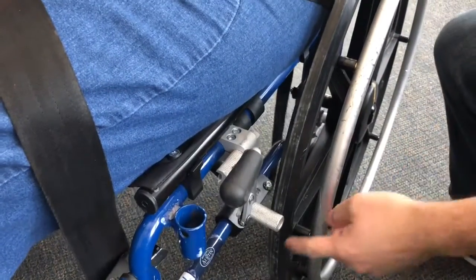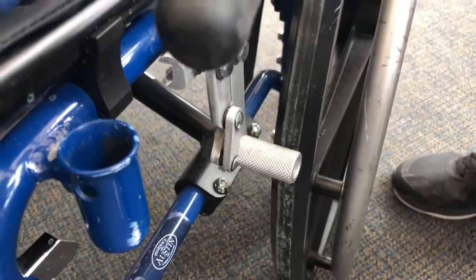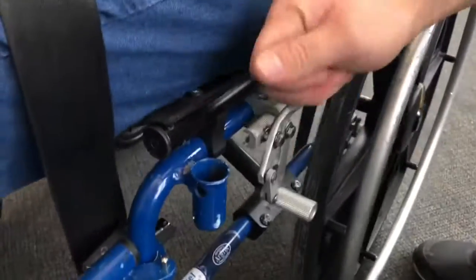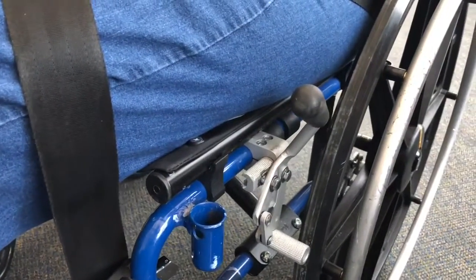There we are. And you can see that's really putting a good indentation in there, so we know we got a really good contact with that brake. So everything seems nice and secure now. It's definitely not going anywhere. And that's how you do it. Nothing else to it.